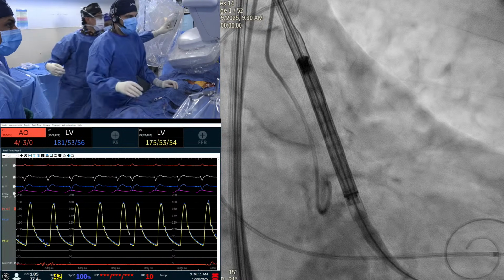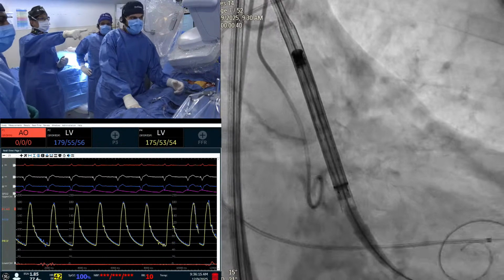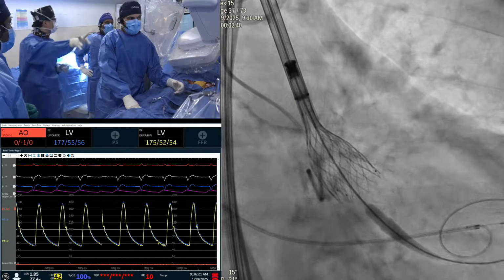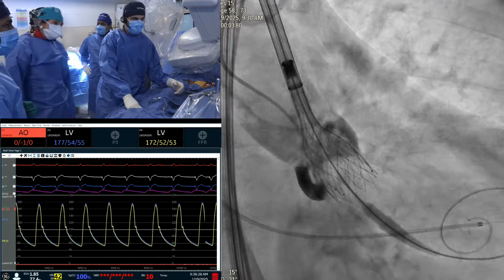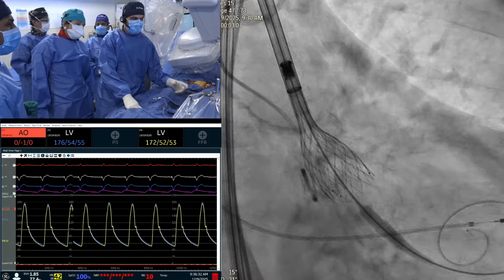If you play this, you can see the head marker is center, facing forward. You directly see center front, and you can see one of the dots goes towards the right side of the screen. Then you know that you have reasonable alignment. Look at this, we call it the 2-1 ratio: 2 on the left, 1 on the right, meaning one of the dots where the commissure is on this view. It's reasonably well aligned. It's not perfect, but it's there.